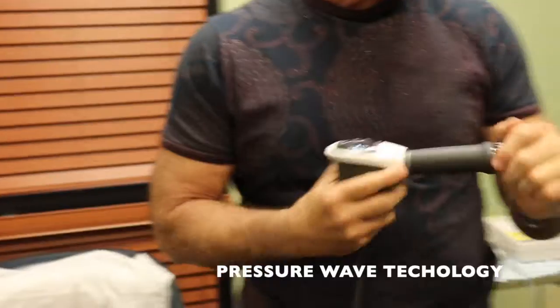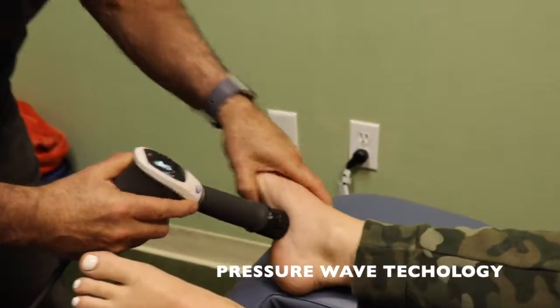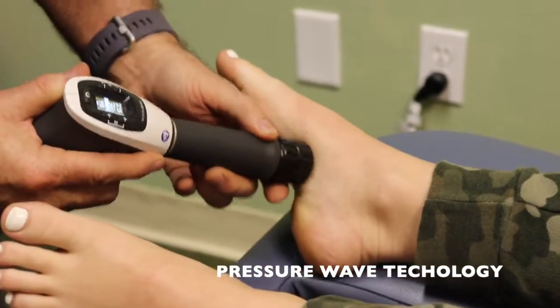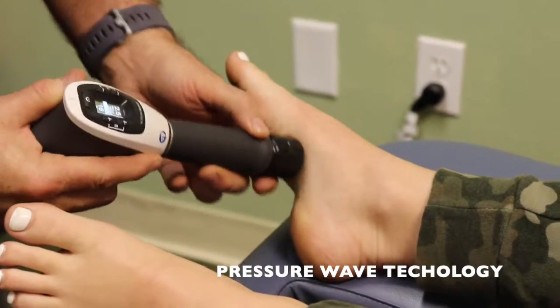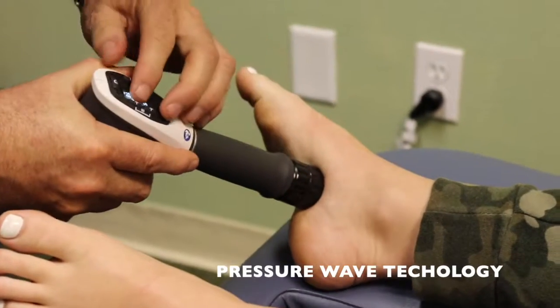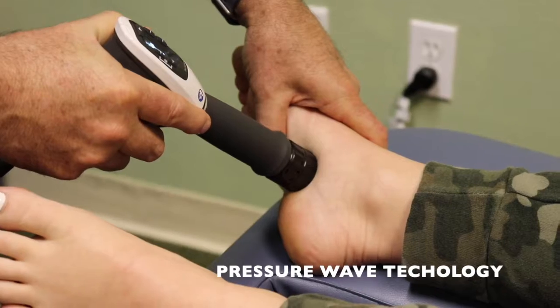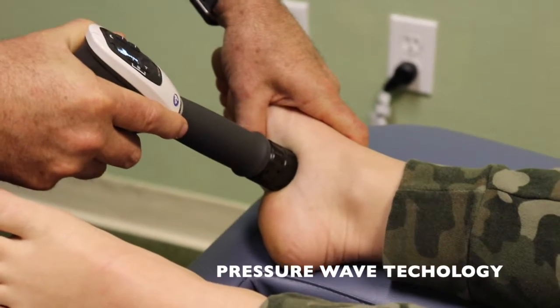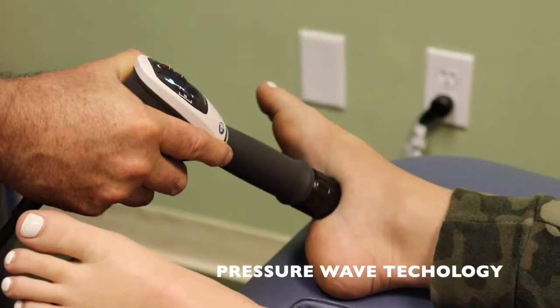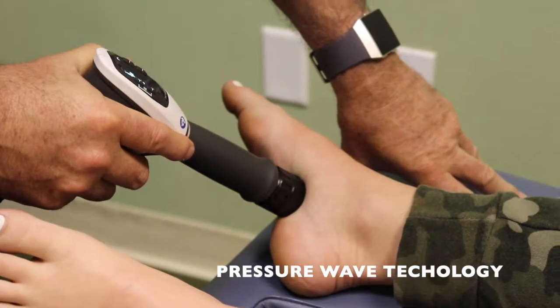And again, if we then demonstrate it on a patient of mine, Brianna, she has a plantar fasciitis. So if I wanted to work the plantar fascia, in this area is ligamentous tissue, we could use the ceramic end, but we'll just use this. I can just work right into the trigger point, which again will sound like this. And again, not too painful, right? No. And I can leave it there. The total treatment time is in the device here, 2,000 impulses, which basically takes about 2 minutes.